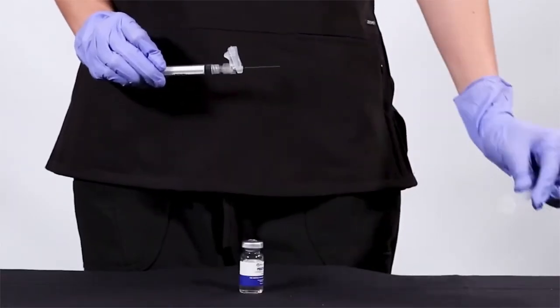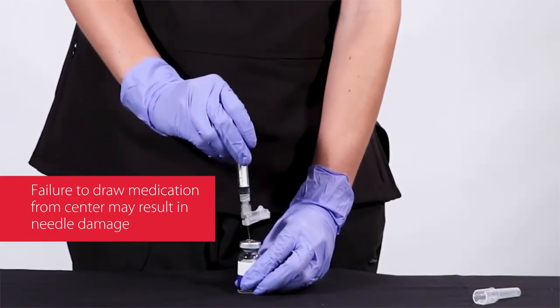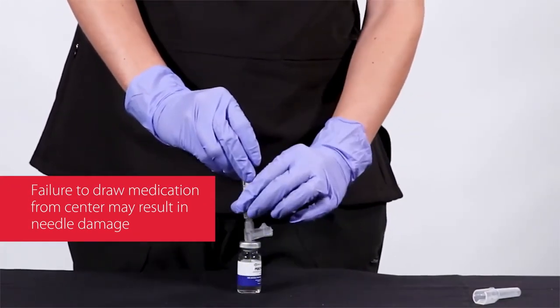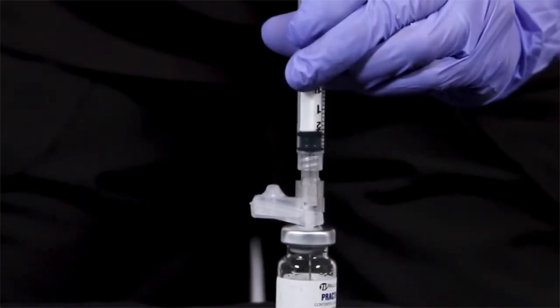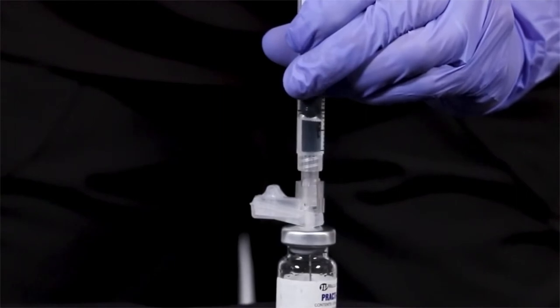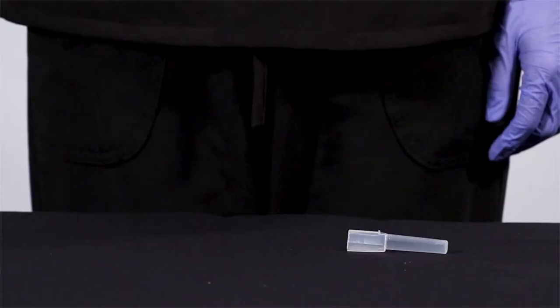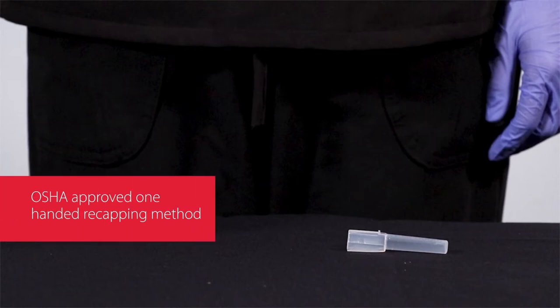Draw up medication from the center of the vial stopper. Failure to do so may cause needle damage. The Magellan safety needle's integral safety shield was designed to provide unrestricted visibility to our clear and bold graduations. After drawing up medication, your facility's protocol may allow you to scoop the sheath back into place using the OSHA-approved one-handed recapping method.